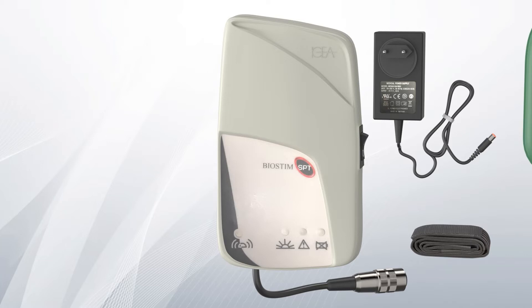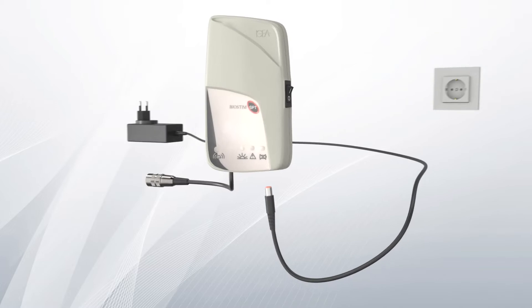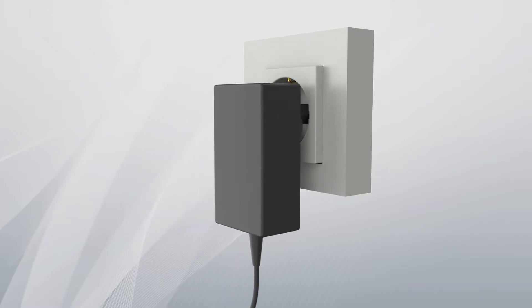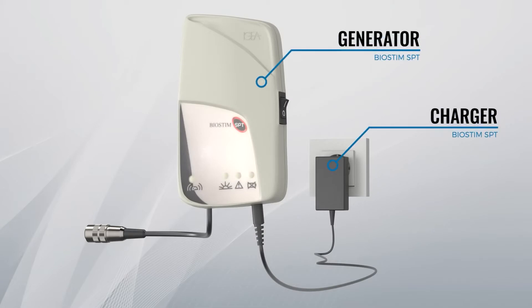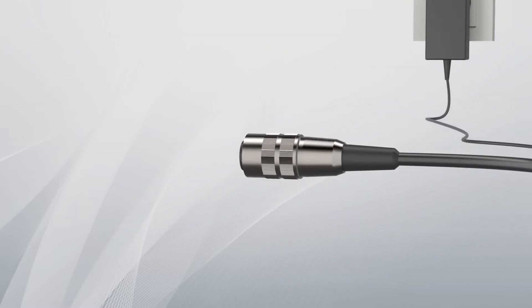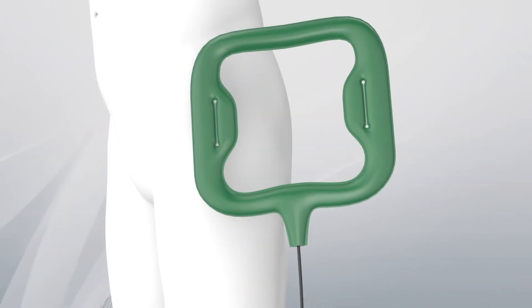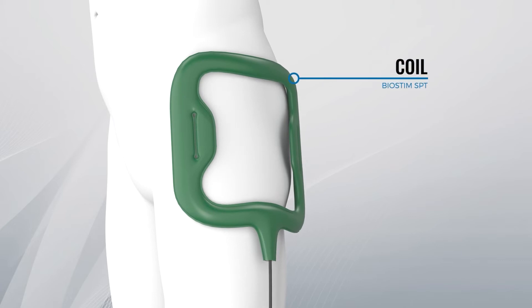It is very simple to use. Connect the power lead to the generator and plug it into the electrical outlet. Place the coil on the area to be treated and secure it with the supplied band without overtightening.